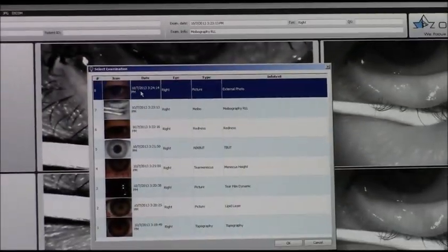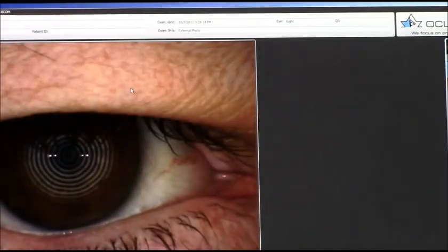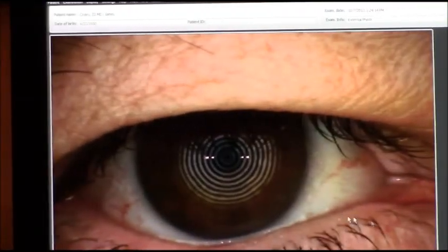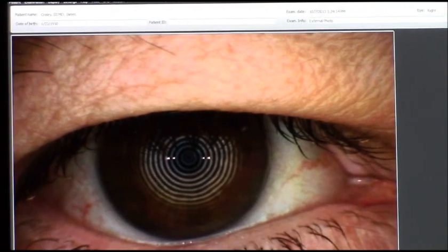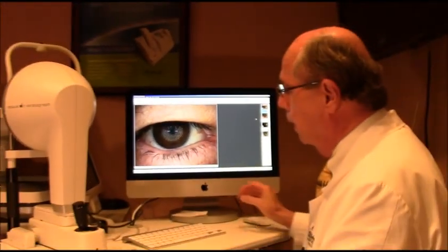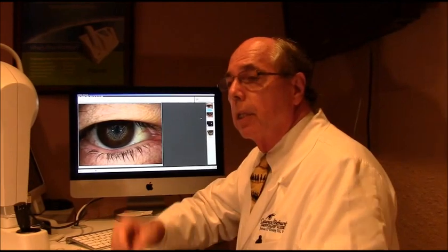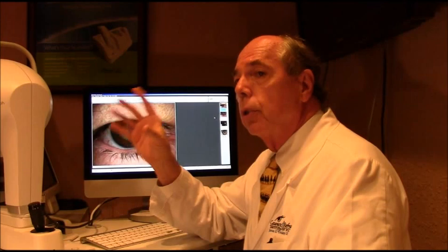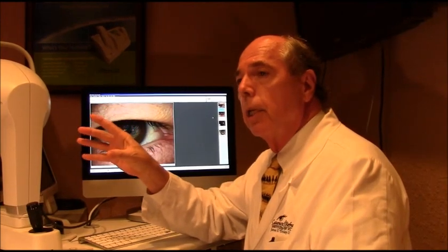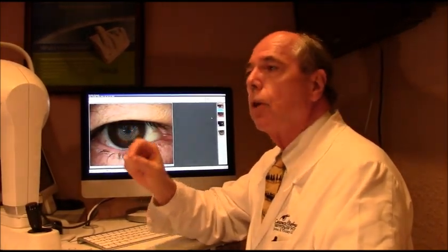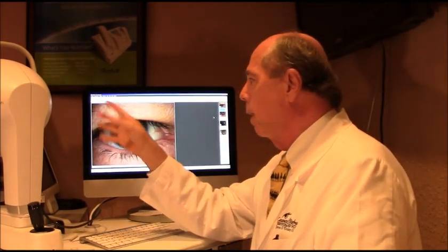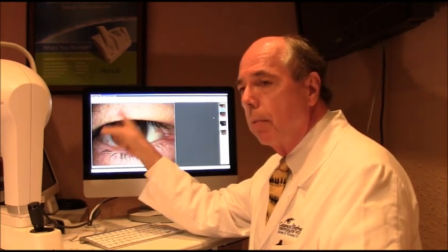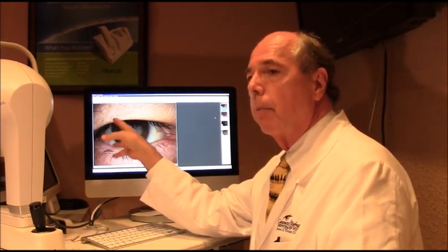The last feature is a photo function. If there were a lid lesion — say someone has skin cancer or something like that — we could take a picture to track the lesion over time. So those are all the different things this machine does. It allows us to diagnose the type of dry eye someone has, and then we come up with a treatment protocol accordingly. This person has meibomian gland disease, so we would treat the meibomian glands to try to improve their dry eye.